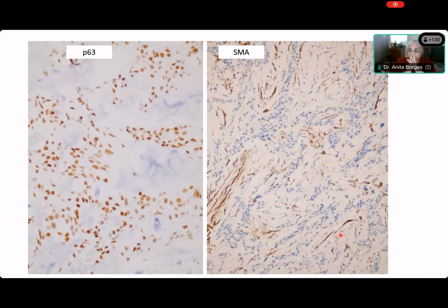Okay. Now, Somik, we said not EMA positive, but we did P63. And P63 is all over the place. So now we want to change our minds. Yes? Yes, ma'am. You want to change your mind. Okay. You want to say it is myoepithelial. Now what about SMA?